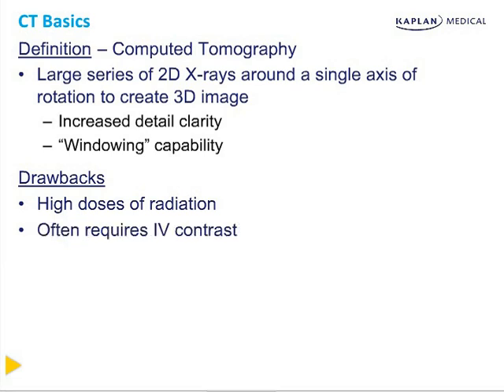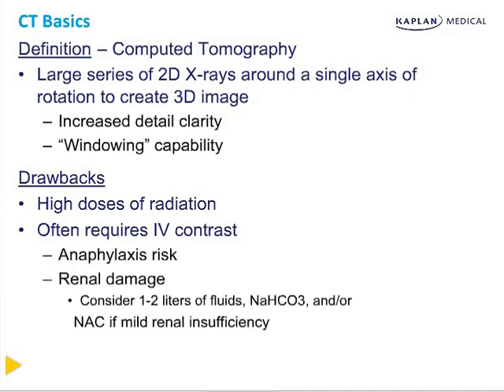Also, many specific types of CT studies require intravenous contrast to help differentiate blood vessels from other anatomic structures. Unfortunately, many people are allergic to this contrast and, in the worst case scenario, it can cause an anaphylactic reaction. Thus, if the question stem mentions an allergy to IV contrast, take it very seriously and don't order a CT with contrast. Also, contrast material is very hard on the kidneys and can cause renal failure, especially in patients who already have kidney disease.